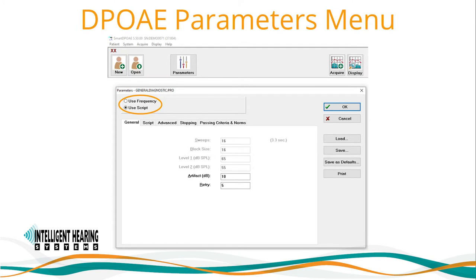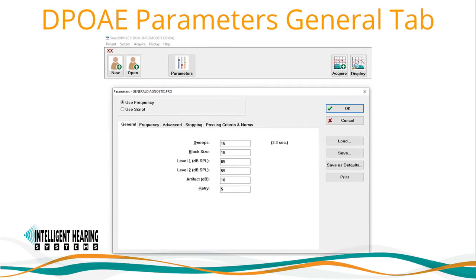When accessing the parameters menu, there are two modes available: the Automated Frequency option or the Manual Script option. When choosing Automated Frequency, the fields for Sweeps, Block Size, and L1/L2 in the General tab become available. Here you can enter the total number of sweeps in the Sweeps field. You can break up acquisition using the Block Size field to increase signal-to-noise ratio. For example, if sweeps and block size both equal 16, you acquire all sweeps at once. If block size is set to 8, the software collects 8 sweeps per frequency pair, then cycles through again, collecting a second set of 8 sweeps to total the requested 16 sweeps.